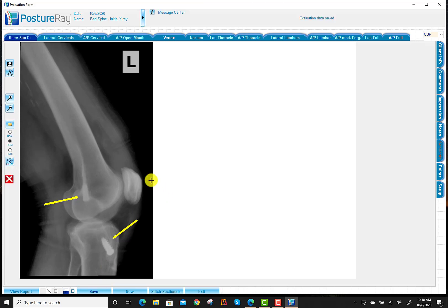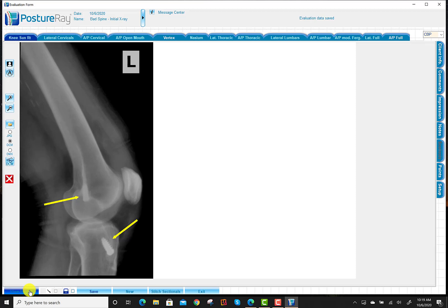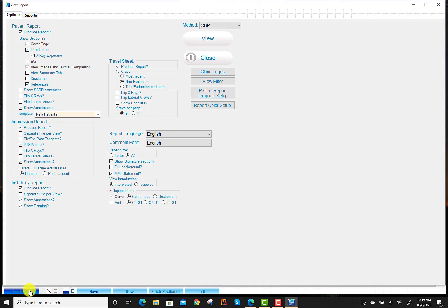And you can annotate on those just like you can. There's just no actual digitization on the non-spine views that we have. With that being said, if I was going to generate a report, of course I can generate a report here. One of the things that I need to bring your attention to is this view filter.